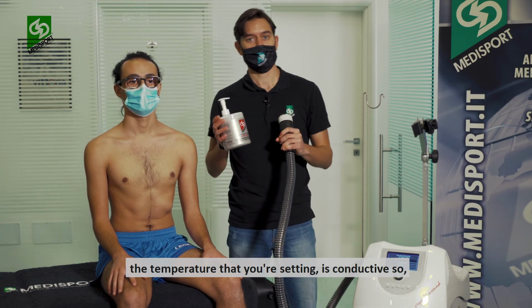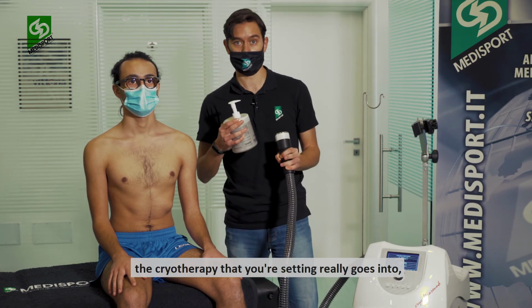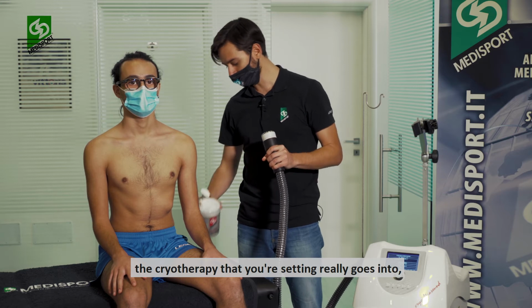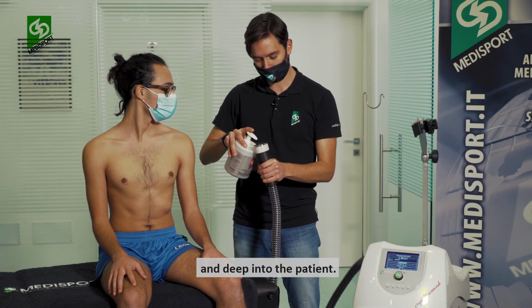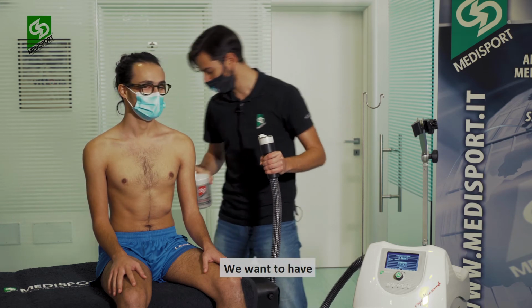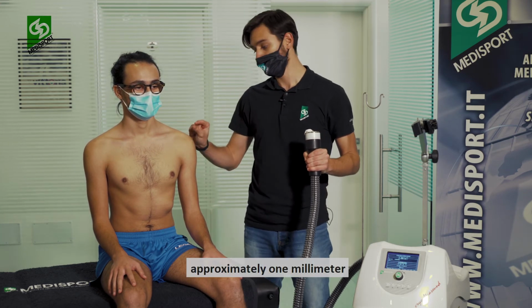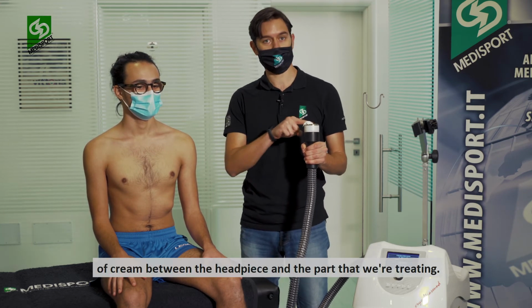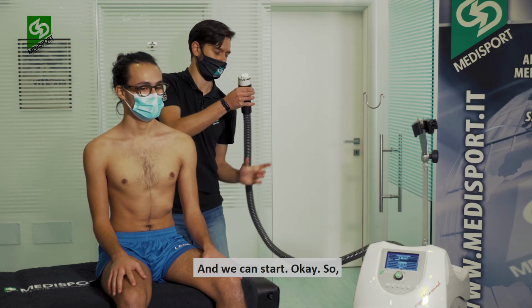It is conductive, so the cryotherapy that you're setting really goes deep into the patient. We want to have approximately 1 millimeter of cream between the headpiece and the part that we're treating, and we can start.